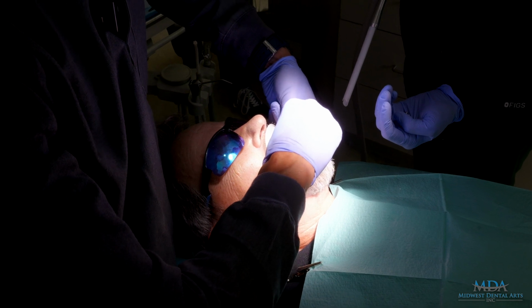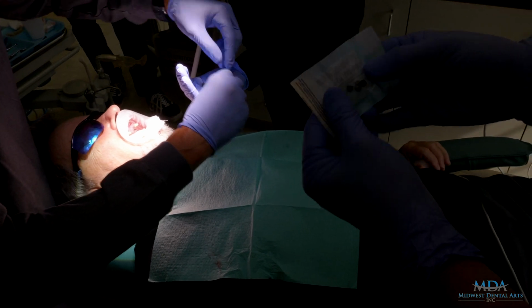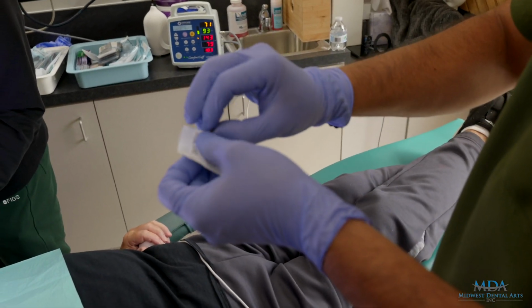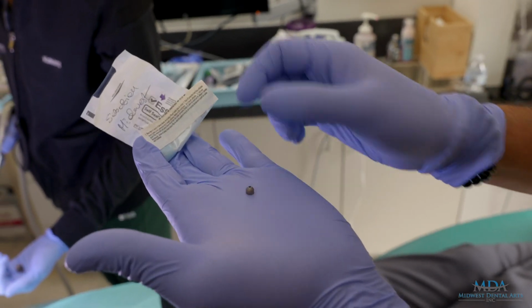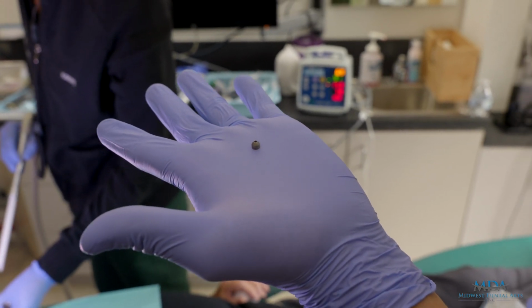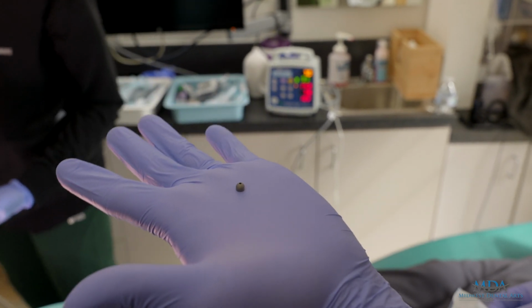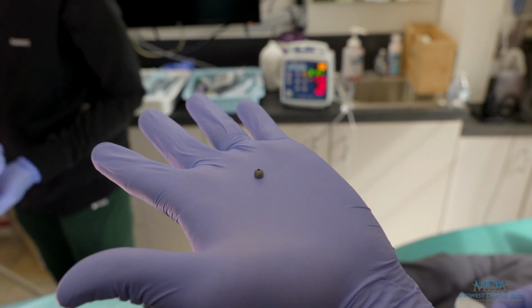So as soon as the doctor finishes taking those off, we're gonna place these right here, which are the bio caps. We have adapted these so they can be scanned as a tissue marker. Open, open. And these are gonna be going on top of the multi-unit abutment. Okay, keep relaxing. That's a great thing. And after the multi-unit abutments are all connected, we'll scan these, and these will be basically our markers for our tissue scans.